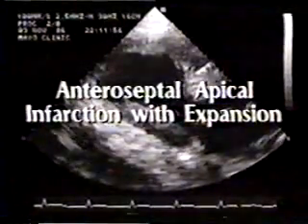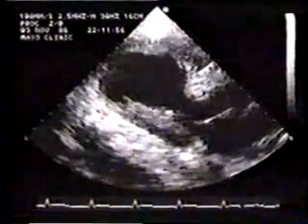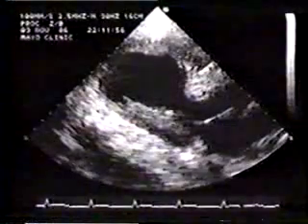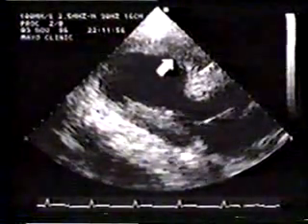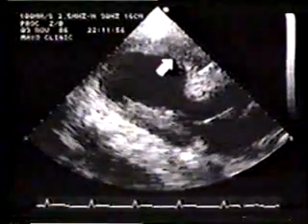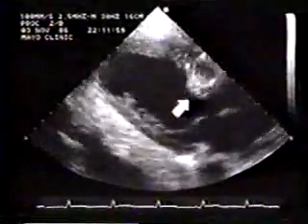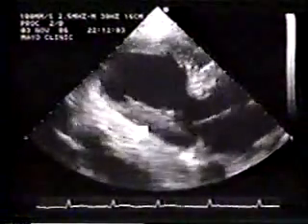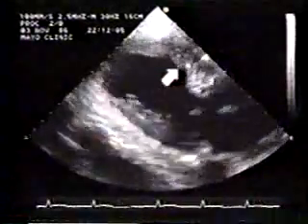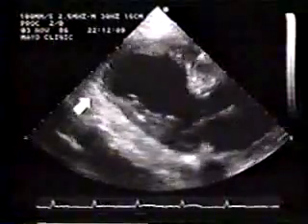This patient was admitted with an anteroseptal apical infarction. Although the septum has not yet completely thinned out, it bulges toward the RV. This represents infarct expansion. In real time, note that the basal septum and inferior wall at base and mid-levels contract normally. The infarcted segments, including the infraoapical, are dyskinetic.